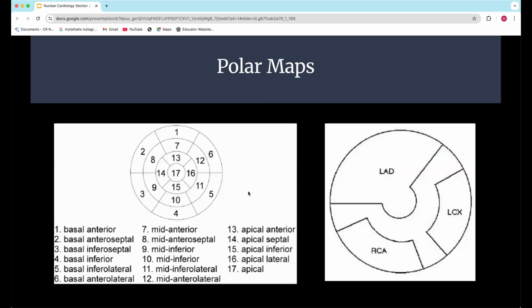The other thing I want to mention: when we do PET, I'm going to go over more ancillary data that will apply to SPECT and to PET, and so I've saved that for the next one. But I do want to at least mention polar maps, because this is where you start to remember earlier I mentioned knowing where your coronary arteries are located and what they're perfusing will help you as you look at images. And what a polar map is, you'll see when you process and you come up with your images. But essentially, remember earlier I talked about the cup, right?